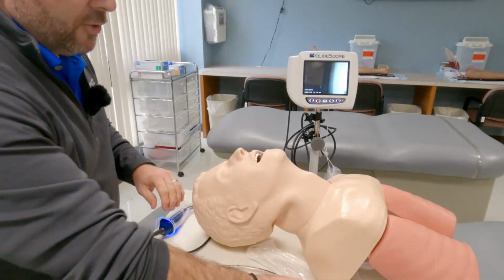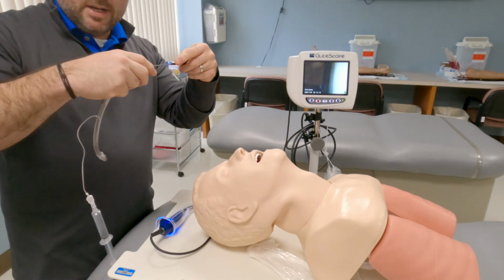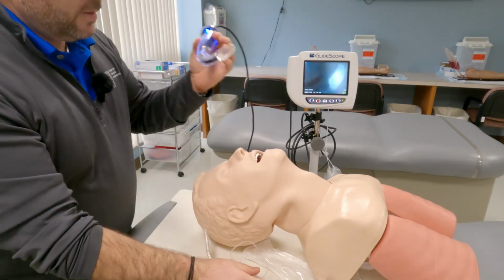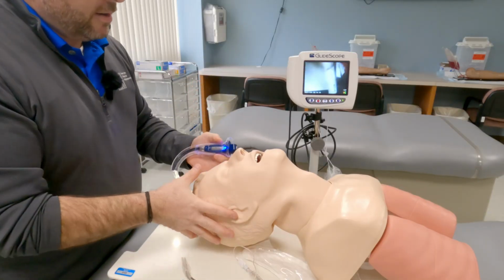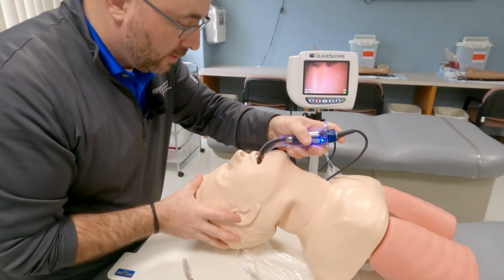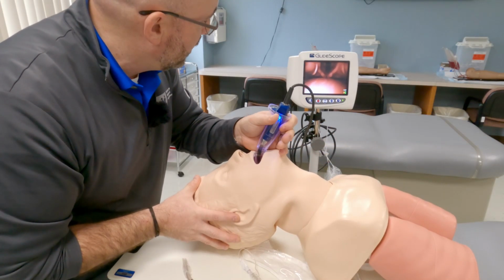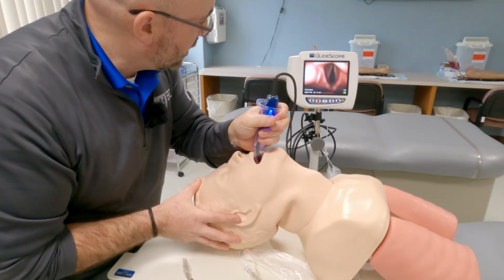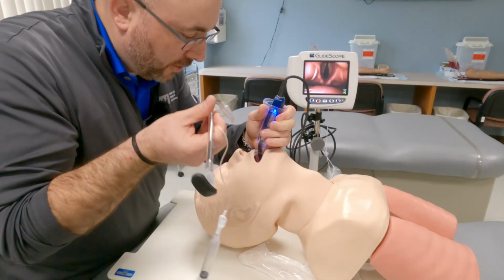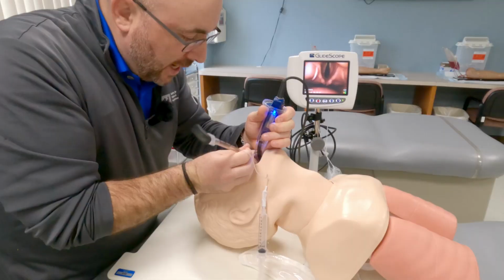One more time through, just for review. For some reason, I'm rhyming everything today. Everything's prepared. Step 1, look at the mouth. Insert, go around the corner. Step 2, look at the monitor. Adjust, lift, adjust until I see the vocal cords. Step 3, look back at the mouth. Insert, endotracheal tube at a 90-degree angle, and then rotate up.